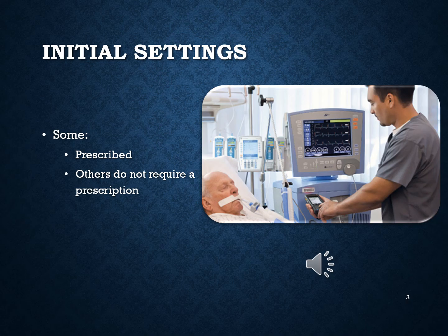When you calculate your patient's ideal body weight, you're determining what your patient's tidal volume range will be, right? So not always will the physician know what that range is. Sometimes they may order a volume that's too high for the patient. And you want to prevent harming your patient, so a way to do that is by double checking the prescribed tidal volume. Now, you don't want to find yourself overventilating your patient or even underventilating them.